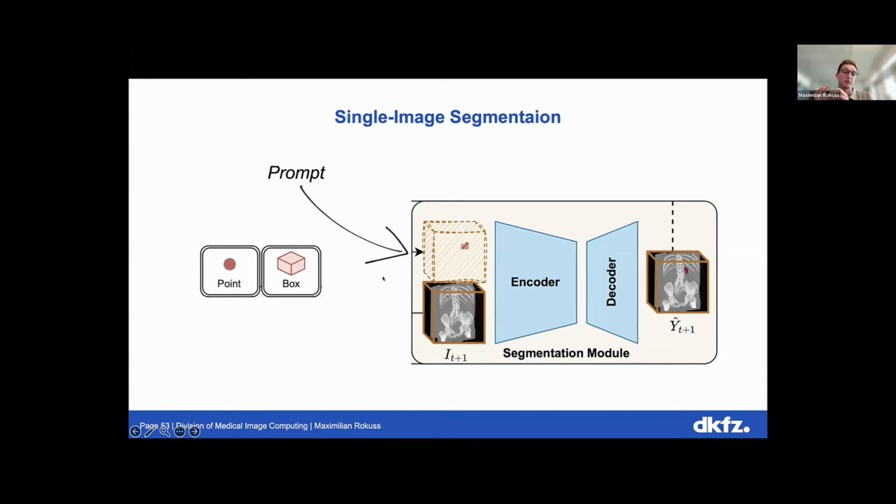And in this case, we're working with point prompts and box prompts. And as you already see here, what this relies on is basically an underlying encoder-decoder structure. But the big difference to many other models, and also many other models in the 2D domain, is that the prompt is encoded in the first iteration, basically. So we call this early prompting, whereas in the SAM architecture, you would just encode the image and then do late prompting in latent space.